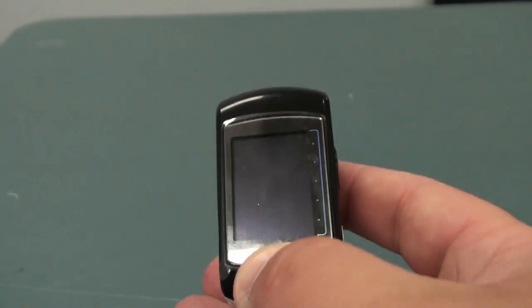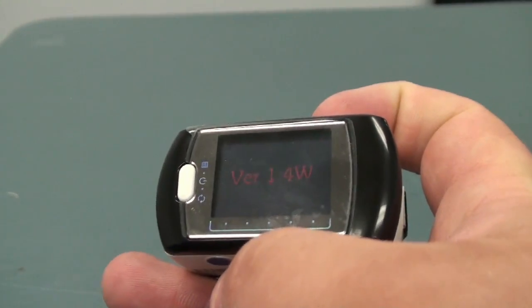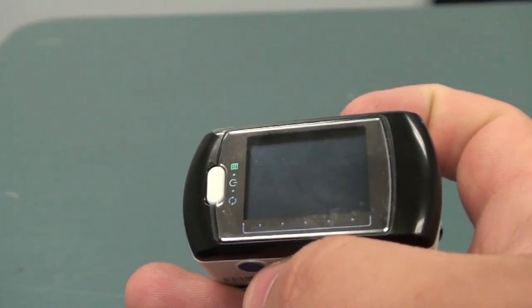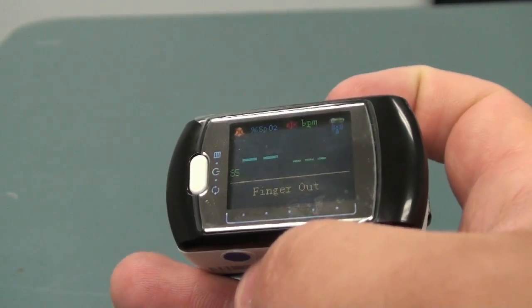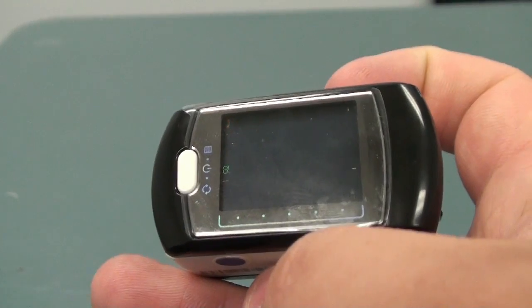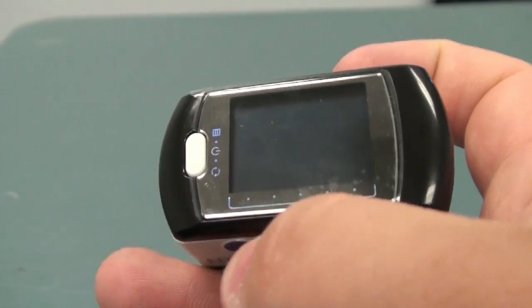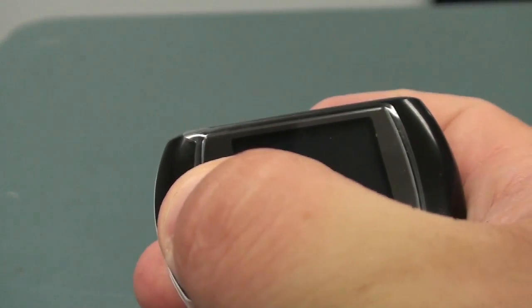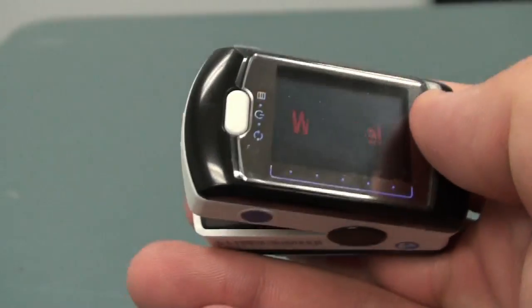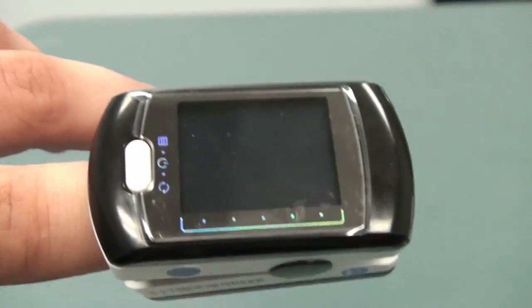To turn the device on, press and hold the power button. The device will turn on with a welcome screen showing you the version of the device. If your finger is out for more than five seconds, the device will shut off. To turn the device back on, wait a few more seconds and press and hold the power button. We recommend inserting the finger as soon as possible to make sure that the power does not turn off.